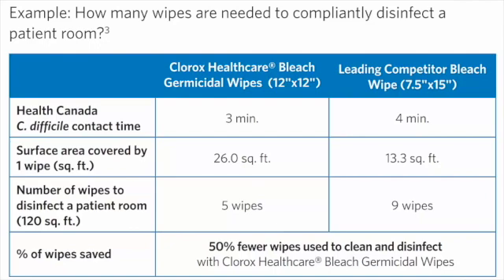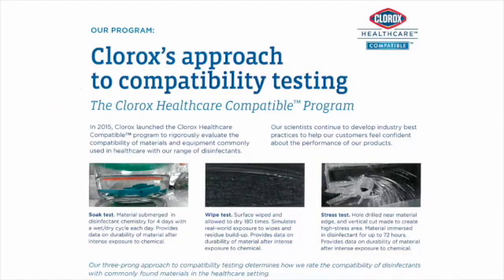All that might be good, but what is the wipe going to do to the surfaces that you're trying to use it against? Clorox have done some interesting research testing different types of surfaces with different types of agents, by soaking, by wiping and then repeating that 180 times, and by stressing the material by, for example, drilling a hole near the edge to create cracks and seeing what happens when the material gets a chance to soak in over several days. I'm about to show you the compatibility chart. It's based on these types of tests. Exposure for 4 days, 180 wipes. What happens when you leave it for 3 days soaking into the material with a broken surface with a hole in it?